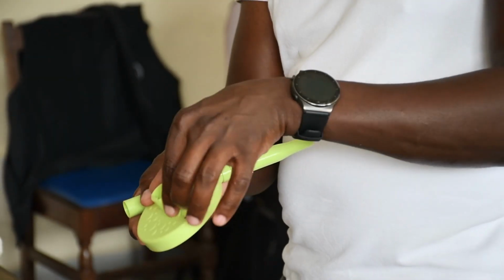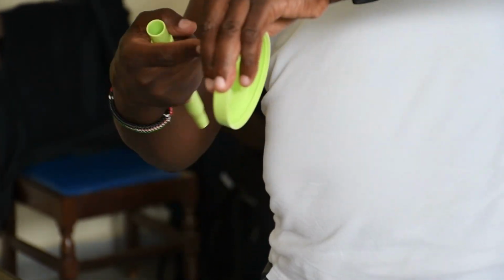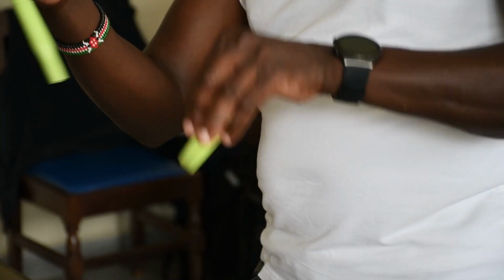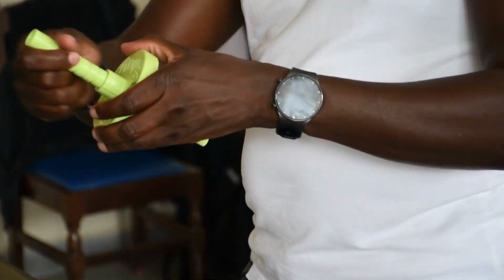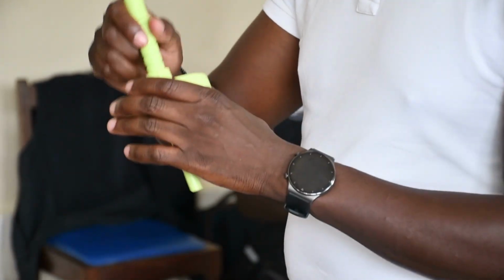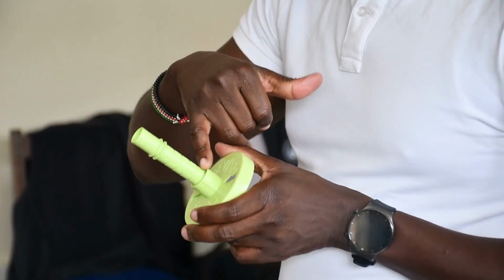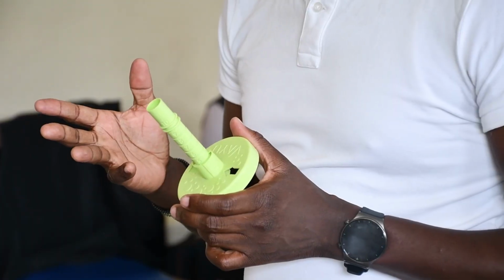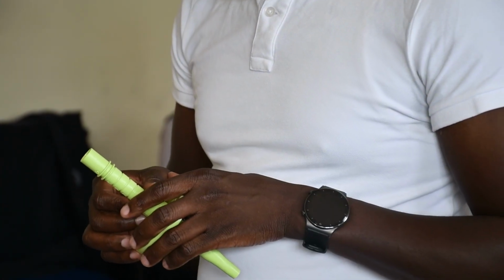Okay? A little bit higher, on the inside. You squeeze it, then you see this. They are the ones that lock the system. So when you release them, this one goes in. When you let it go, this one is locked. Okay? So what will happen is, if someone struggles with this and just squeezes, these two will not function. Okay? So you want to make sure that you do that particular operation.